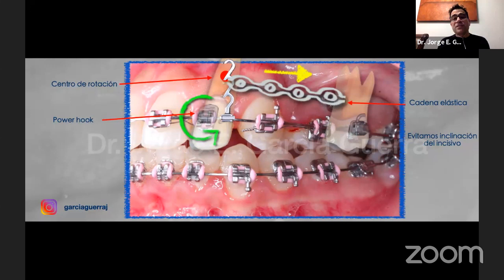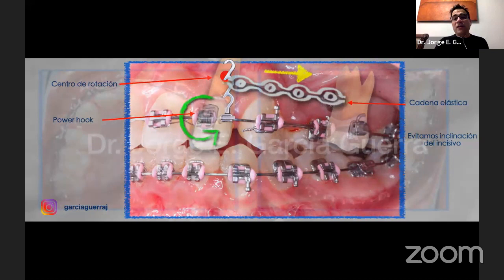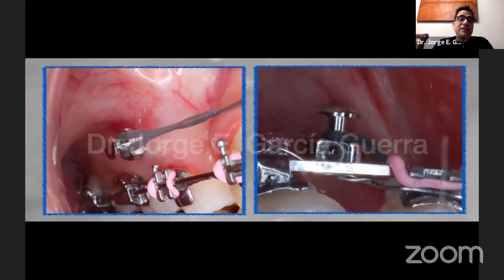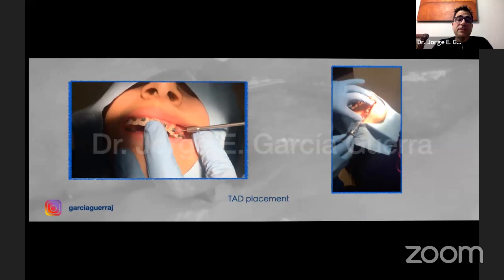But also in a lot of cases, we're gonna have some soreness of the tissue. I'm gonna show you, this patient had a lot of inflammation as we close the space. This is the day we insert them. So you can see that they're in, and we're gonna use them and attach gingiva so we don't have a lot of negative effects there. Now, this is just a little video so you can see how we put them on. It's very easy. I'm sorry, I'm gonna go back a little bit.